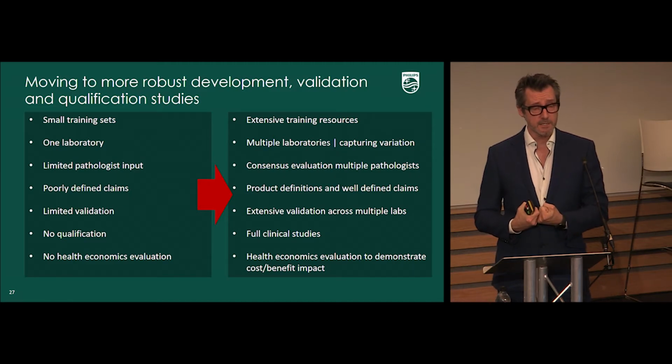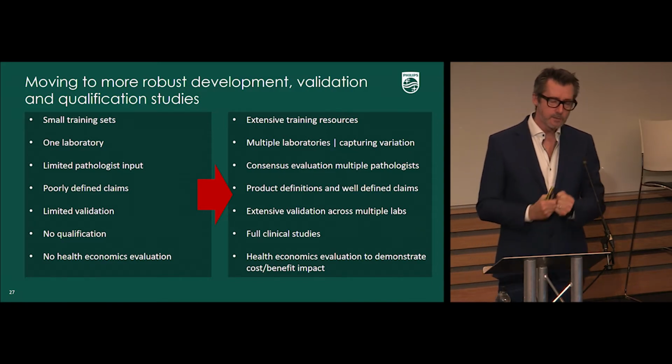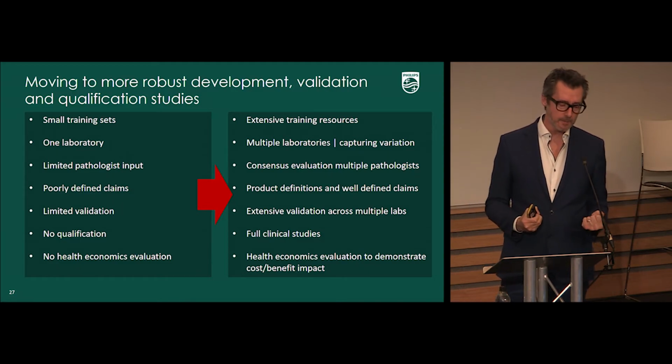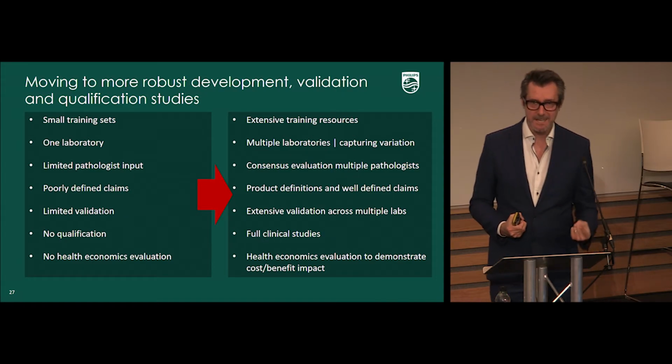Full clinical studies are necessary if we want to take these from research algorithms into clinical algorithms that are IVD cleared. It's really important that we do those robust clinical studies and health economics evaluation to demonstrate the cost-benefit impact of these. This takes time.